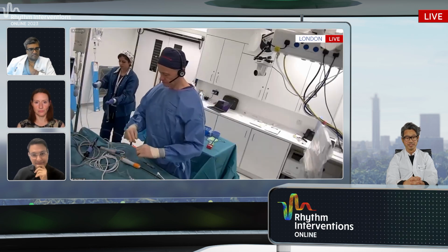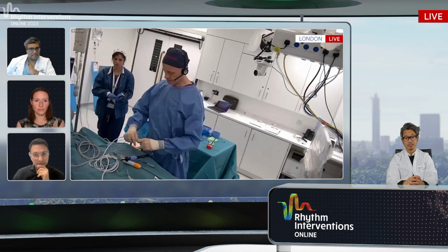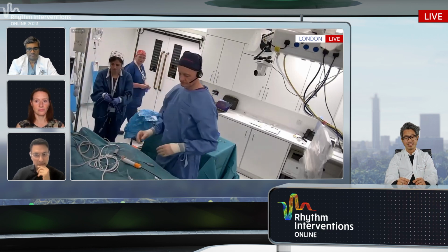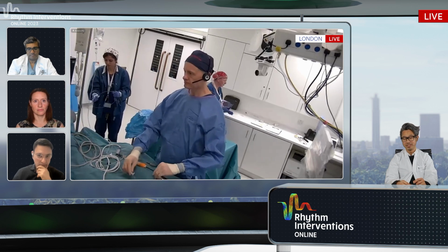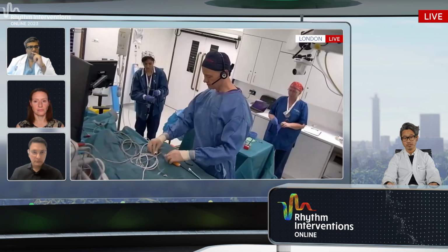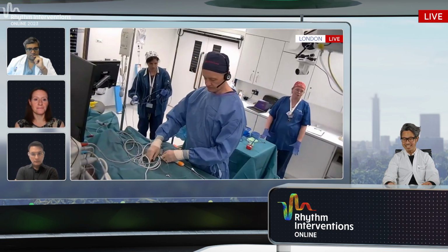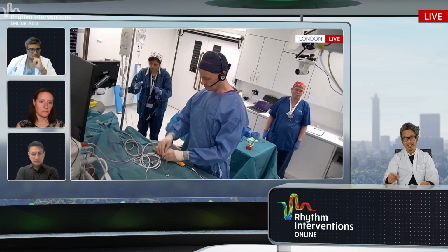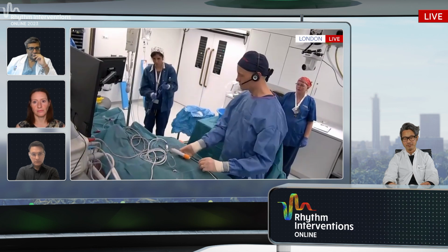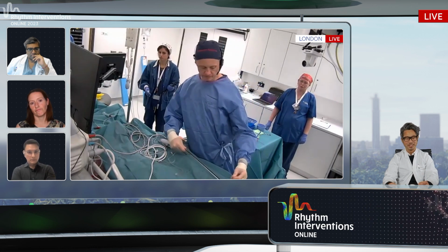Yeah, wow, that's amazing. And also, I think this is very educative, and you took a very didactic approach to how to understand and how to come to the final diagnosis of CTI-dependent flutter. I think we should also not forget looking at electrograms, even taking this little tiny information, as Richard beautifully showed, distal, proximal, distal activation, what to expect in what region first, and then sort by sort, basically ruling out potential mechanisms.